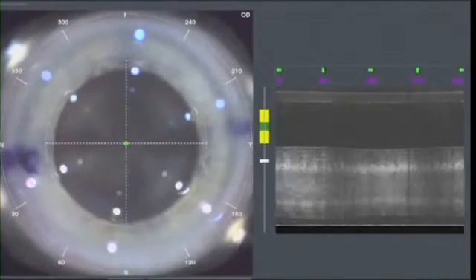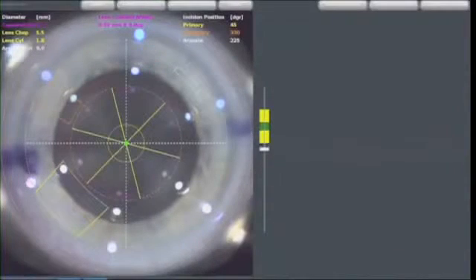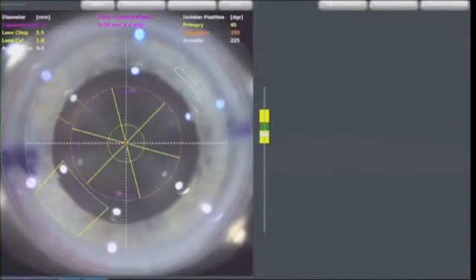Let's spend a minute and watch the laser work in real time. I have edited this video clip, but the entire laser procedure takes less than three minutes.